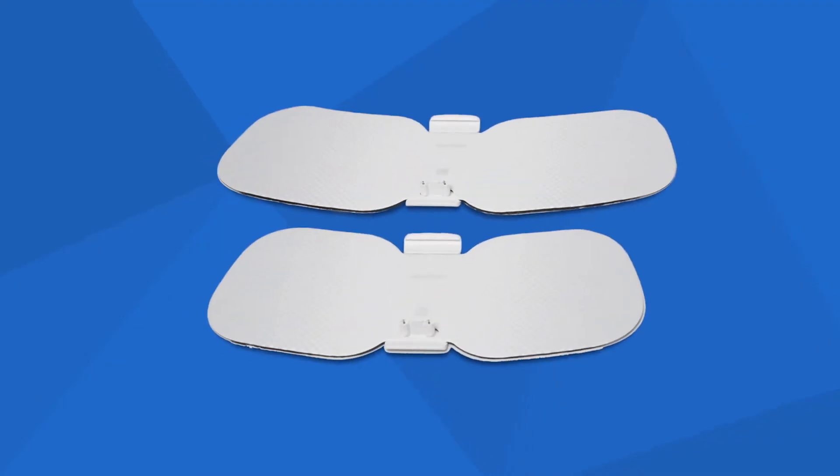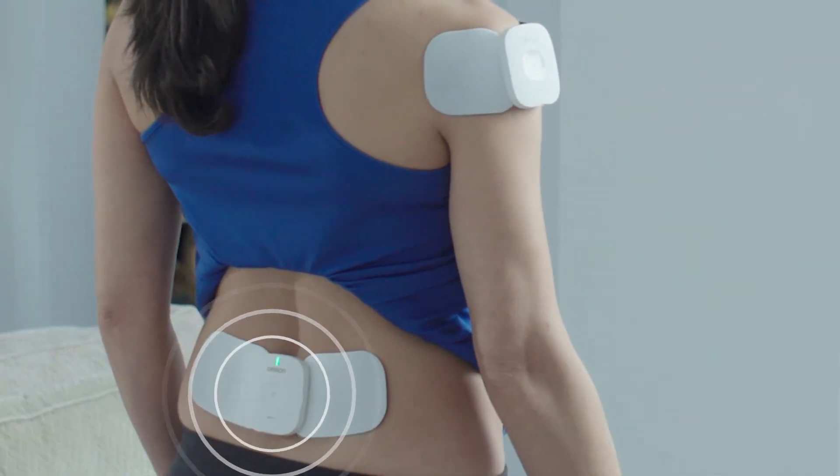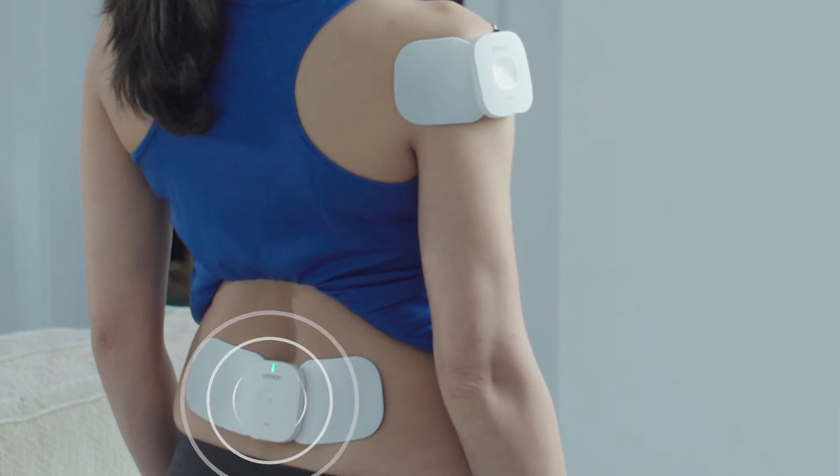It comes with two soft contouring pads, one medium and one large, which gently adhere to the skin and provide targeted, powerful pain relief.